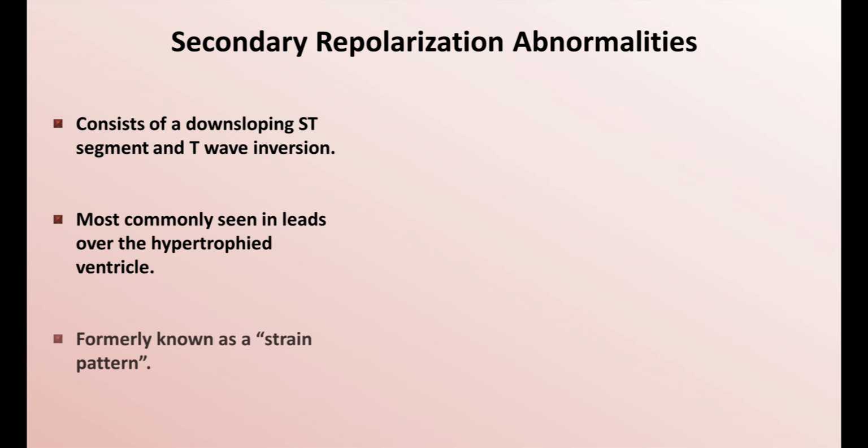This was formerly known as a strain pattern because it was felt to be secondary to an overworked ventricle trying to pump against excessive afterload. As with many prior beliefs in medicine, reality has proven to be a bit more complicated, so usage of the term strain pattern is no longer recommended.